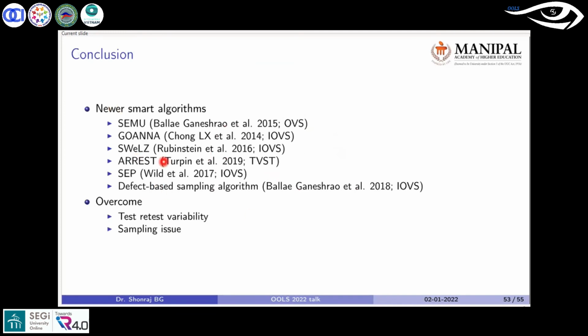So to summarize, perimetric test algorithms are not always good or always the gold standard. There is an issue with the perimetric test algorithms. There are many issues, but I'm just going to concentrate on these two main ones.